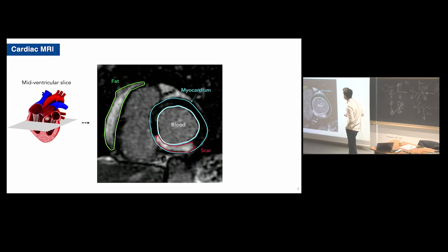And we could also see the myocardium that is separated by 2 layers, the epicardium and the endocardium. And we have the blood cavity of the left ventricle in there, the blood cavity of the right ventricle in there. And if there is a scar, we want to assess the size of the scar. Remember, this is a very important biomarker. We will see it with bright pixels within the left ventricle. So this is a typical example, but I'll come back to this kind of acquisition later.